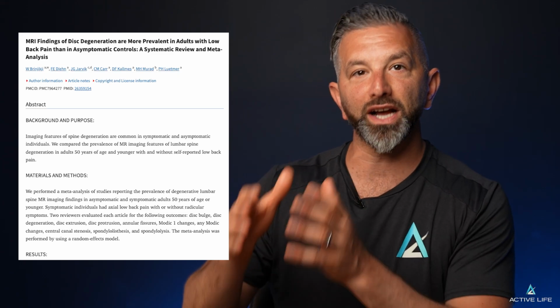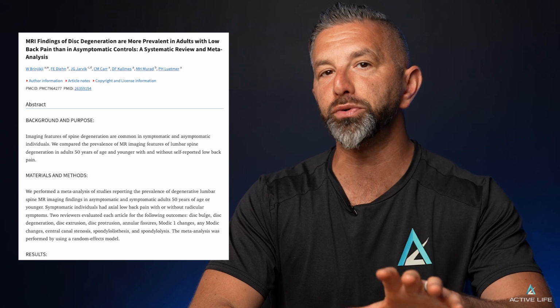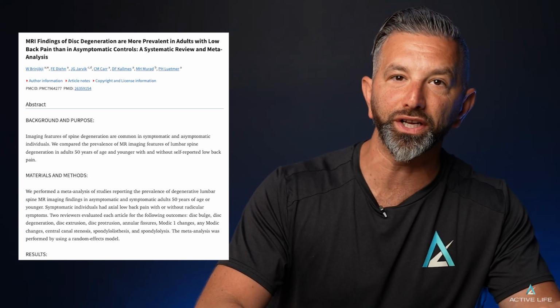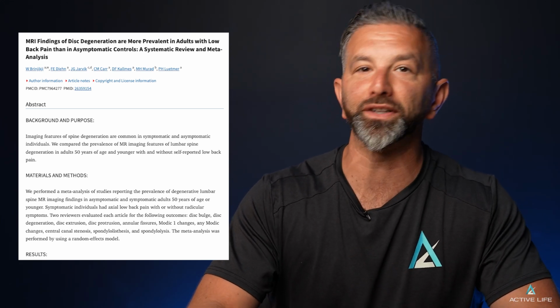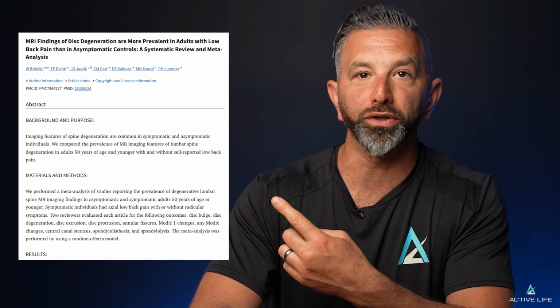But what's important for you to know is that she has these findings, which means that you might also have these findings, but you might have pain, which is what led you to getting the MRI. And so you might think that that pain is coming from that disc, but the reality is a lot of people have these kinds of disc herniations without any symptoms at all, which means that you having the pain and the disc herniation is not necessarily indicative that the disc herniation is what's causing the pain. I hope that was clear. Here's a study that you can look at that will demonstrate that for you. Let's keep moving on to the terminology in her MRI.